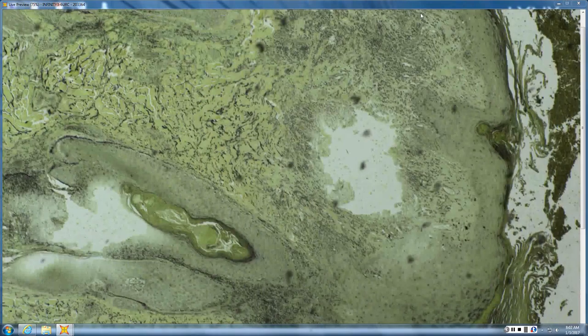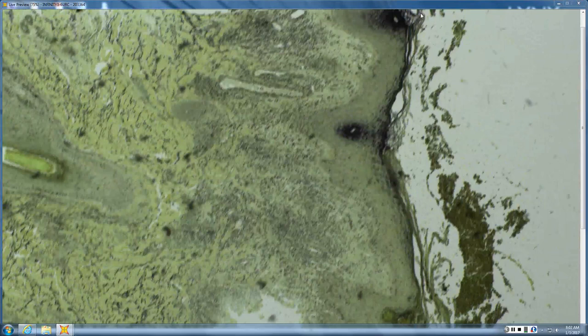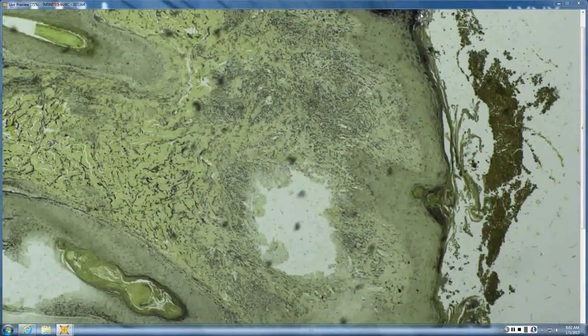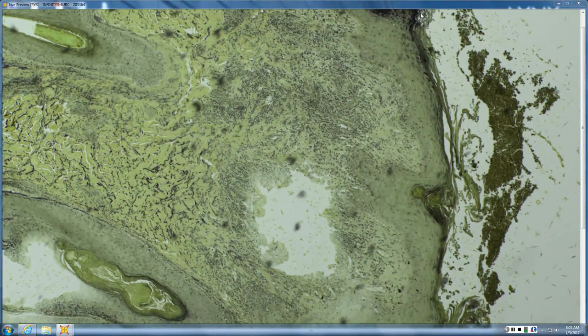Very good. Okay, and this is an elastic stain. We're too early to see a whole lot of elastic loss in this one. We're kind of superficial around the area, more actually of the infundibulum than the isthmus, with some lichenoid interface. So I'd favor LPP, but lichenoid lupus could look similar, and a DIF would be the way you tell them apart.